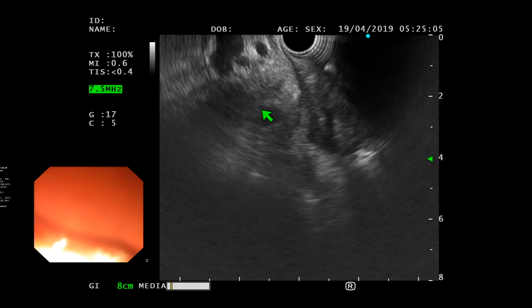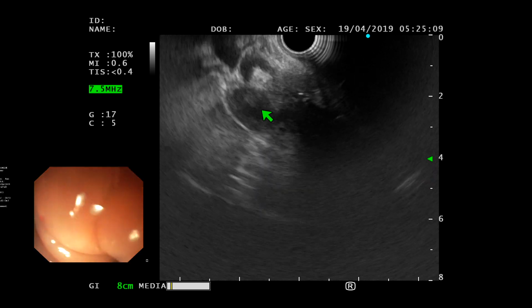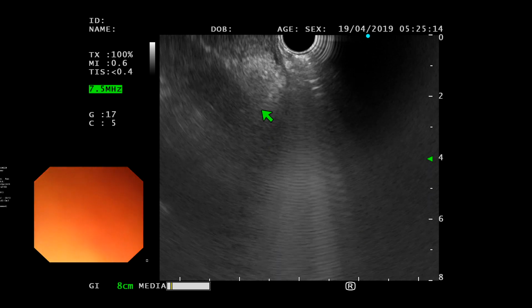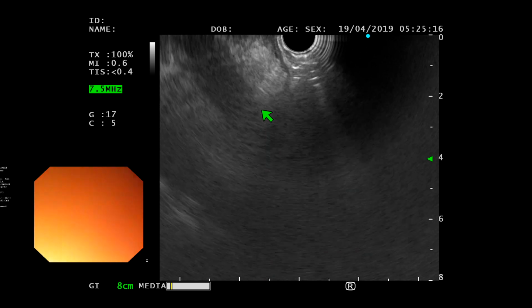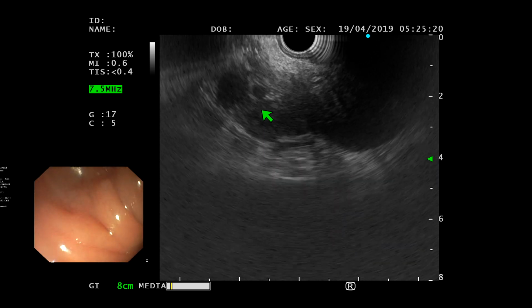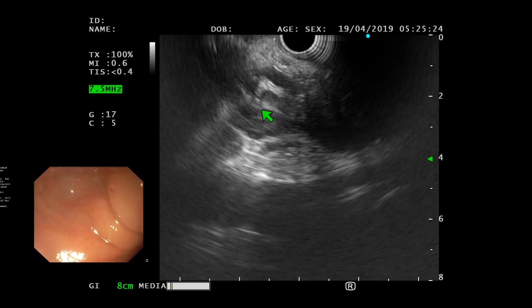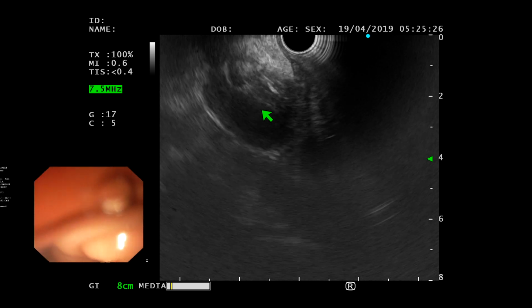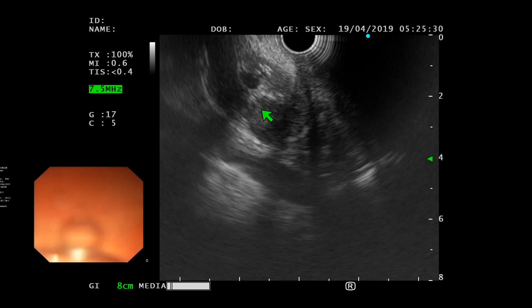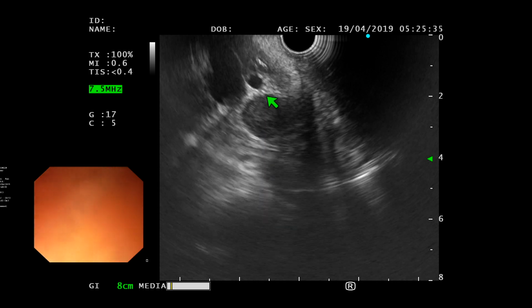Well, my feeling is she's got a mass, Mustafa, I think. Yeah, and what? Is that a large lymph node, do you think? Yeah. Let me just see. She has had a stent put in, did somebody say. Oh yeah, we can see it. Yeah, that's a stent. Can you see that? Yep. We're just pointing it out to the audience here. Yeah, you can see the air refluxing up the duct.